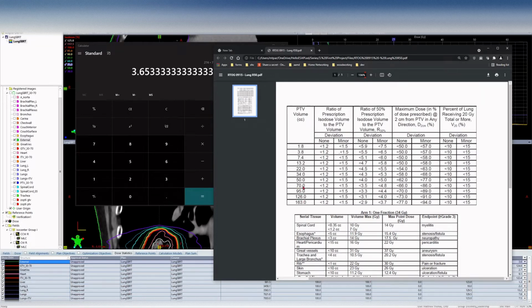And basically what you do is you interpolate between here and here and here and here. You know your volume, so then you need to calculate the interpolation value between 3.5 and 3.3. So that's another thing that we can and will do. We'll program that, so based on the PTV's volume, we'll be able to figure out programmatically what the ideal ratio and the acceptable variation values should be, right?